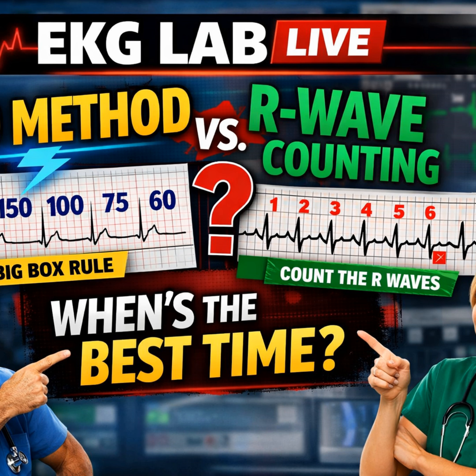I would frame that differently. I'd argue that relying only on the strip method promotes diagnostic laziness. Laziness? Yes. Look at the step-by-step approach in the UNC guide. It goes rate, rhythm, axis, intervals. We have to measure intervals. You need to know if the PR interval is longer than 0.2 seconds to diagnose a first-degree block. You need to know if the QRS is less than 0.12 seconds wide.